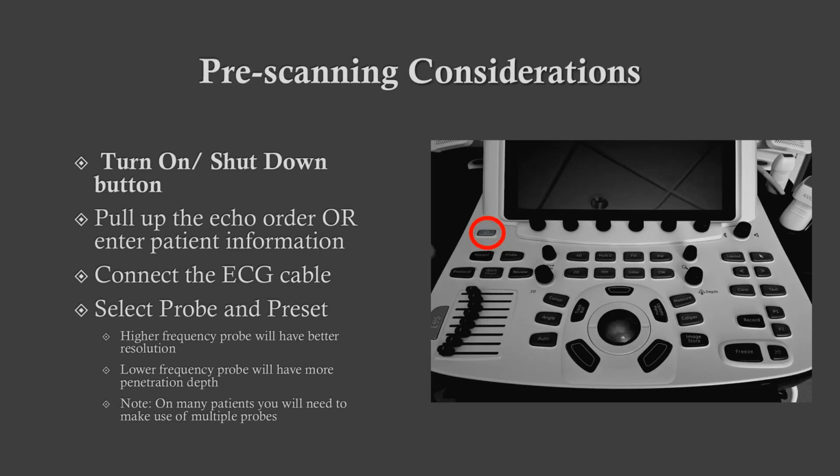Before heading to the patient's bedside, there are a few pre-scanning considerations that you need to be aware of. Familiarize yourself with the ultrasound system that you are going to use and know how to turn on or shut down the machine. Here we see the turn on and off button circled in red on this particular GE ultrasound system.